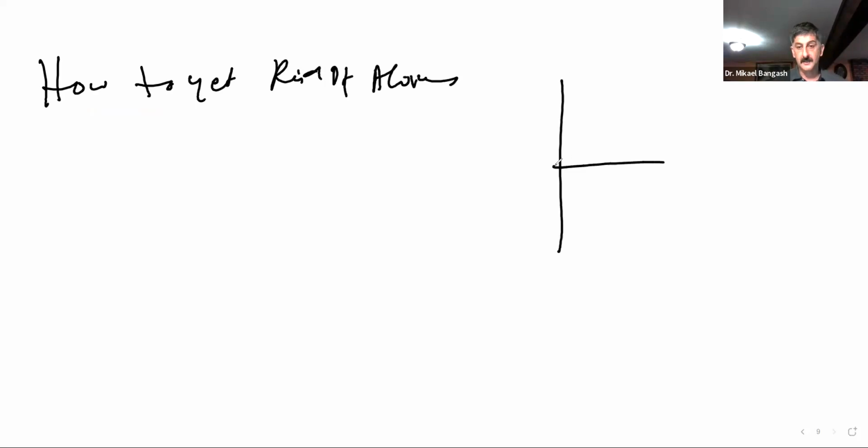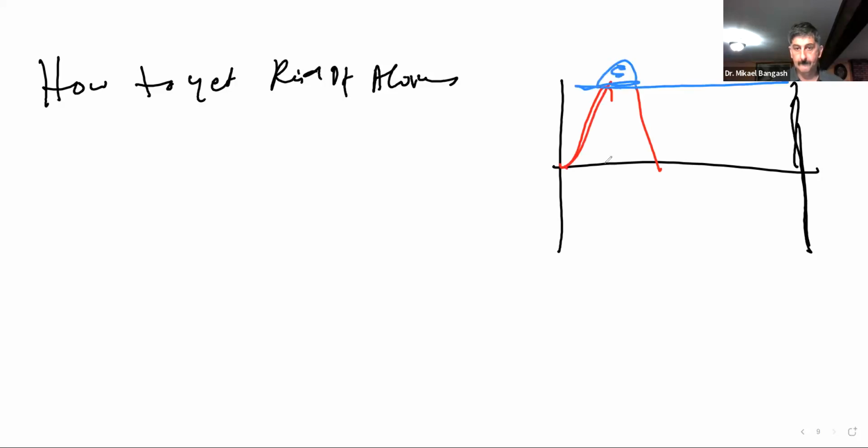Because, ladies, he had a Doppler shift with aliasing.